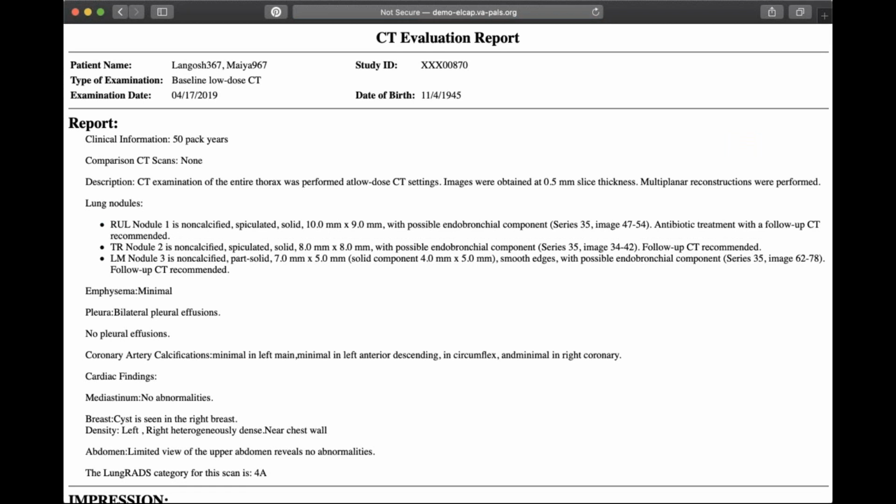So this is Larry. Yeah, go ahead, Larry. I have a quick question about the sorting. So when the CT form is first filled out, sorting them by size is fine. However, are they resorted later? I presume that nodule 1, once this is filed, should always be nodule 1, even if some other nodule gets larger later. That's correct. It's only on the baseline scan that they are sorted by size. After that, they stay in the same order. Okay. And that's been checked, and in fact, it works exactly as advertised, which is great. Awesome. Good job, Tom.